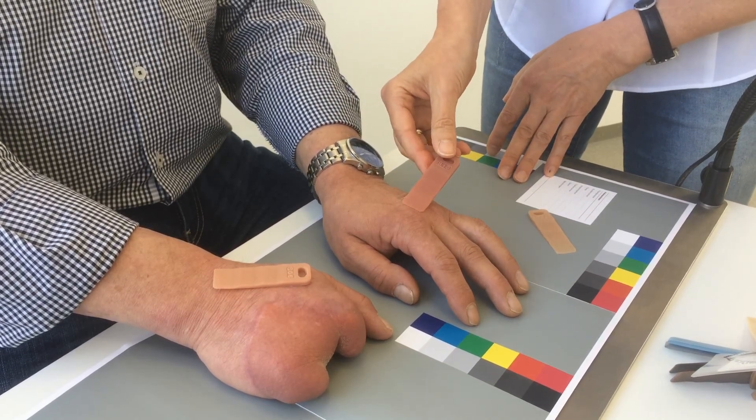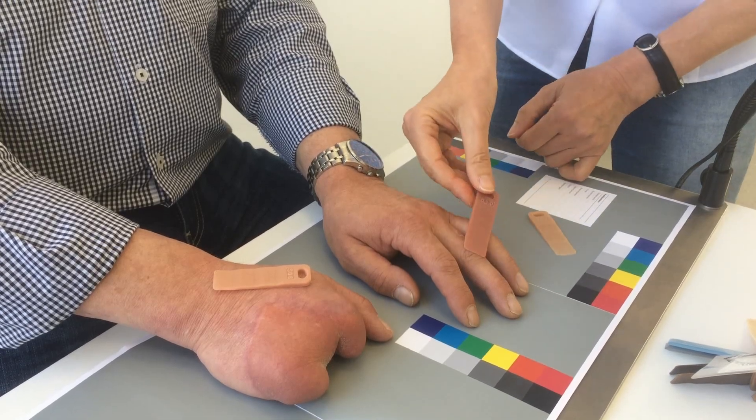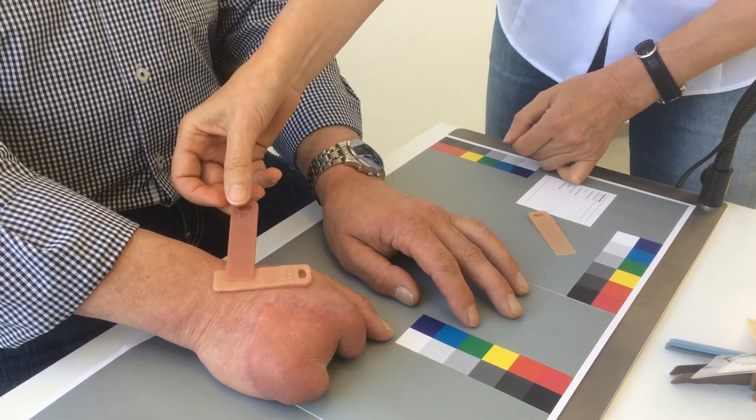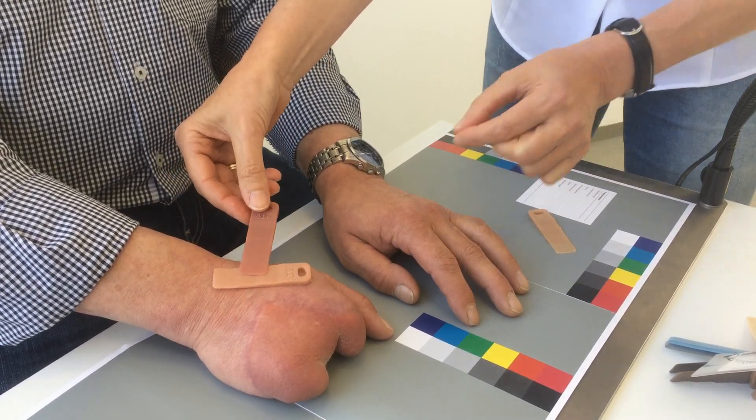I also mix the character color, which I have already selected here in the joints using thickness 1 on the color sample, with the base color on the back of the hand to smooth out inconsistencies in the skin.